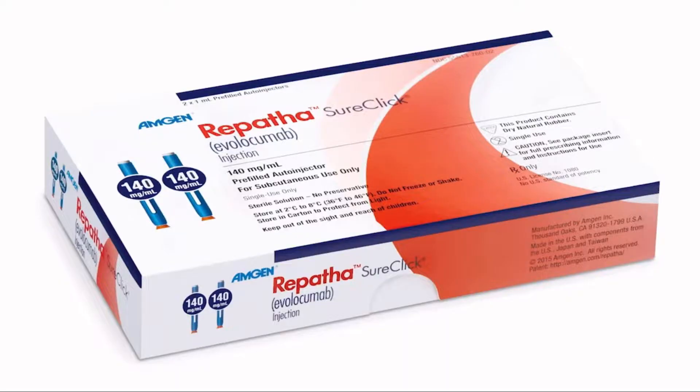Hi, I'm Misty. I've been a Repatha patient for three years, and today I'm going to show you how to take your Repatha injection using a SureClick auto-injector.